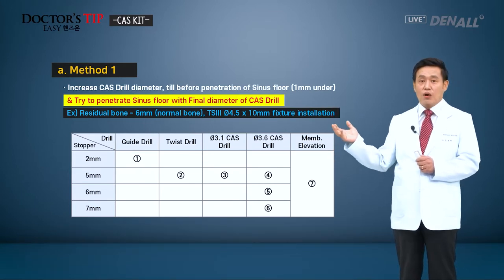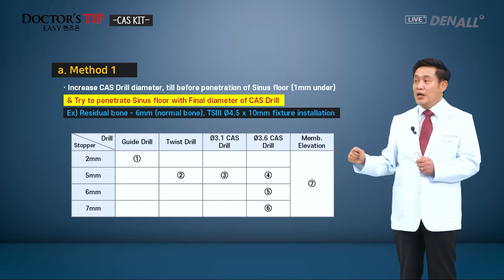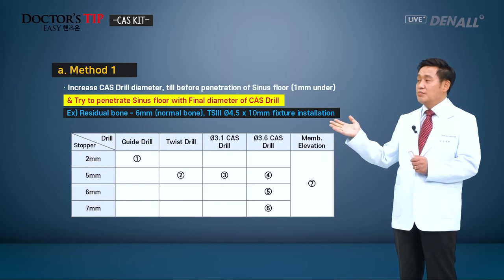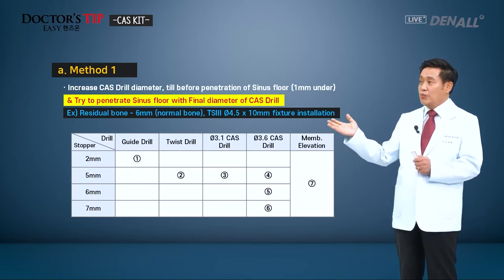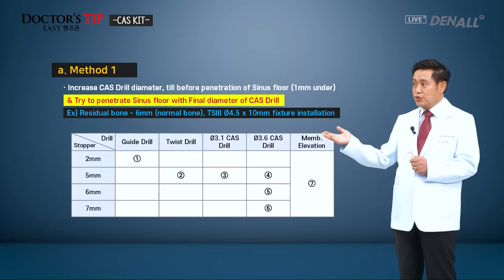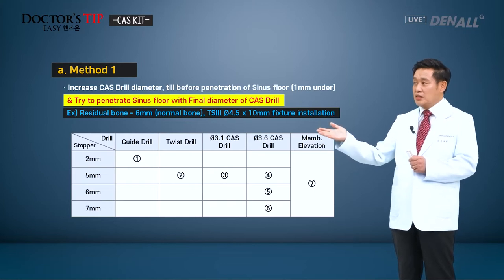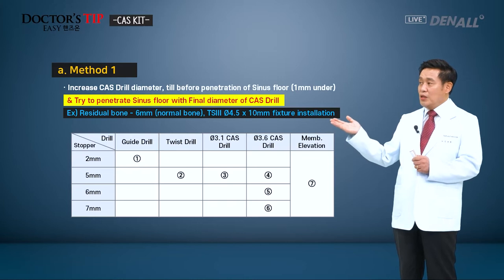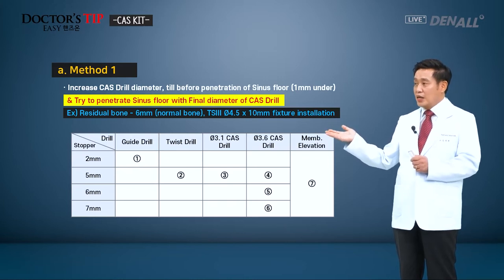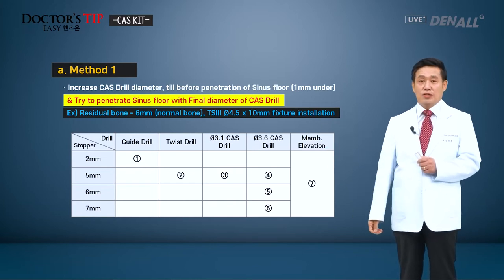The last one, fitting the fixture diameter, the thickest diameter drill is used to penetrate into the sinus floor to minimize the sinus membrane damage. Thicker CAS drill would be used to penetrate into the sinus floor without damaging the sinus membrane. First, the guide drill, then twist drill 5 millimeters, 3.1 CAS drill, and then 3.6 CAS drill, 5 millimeter stoppers. So stoppers are changed to advance into the sinus floor.